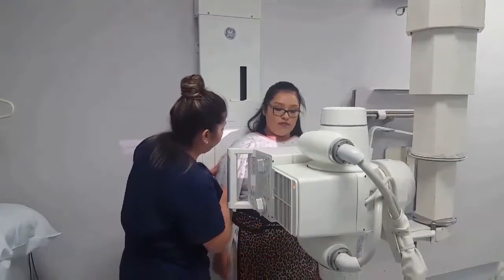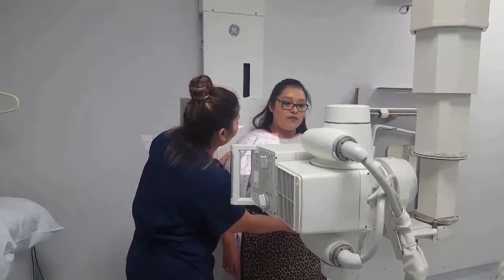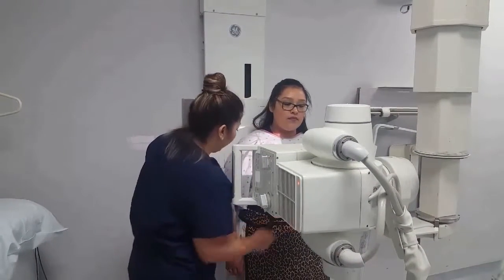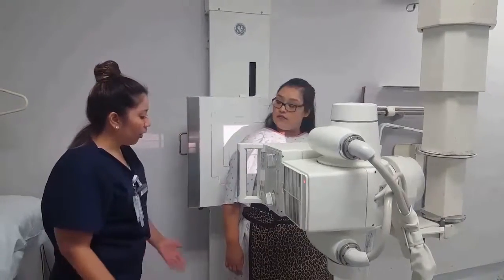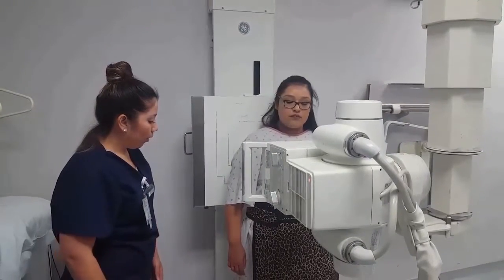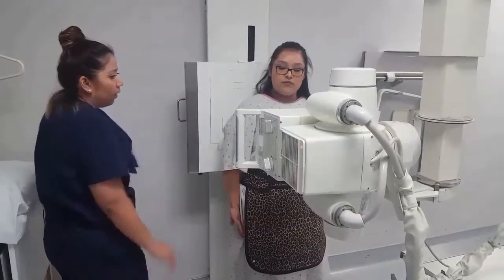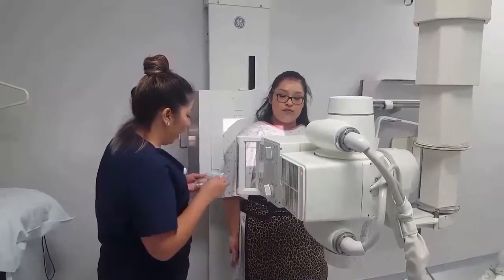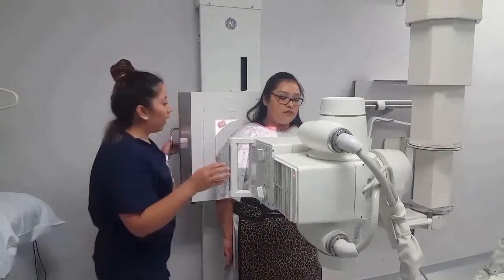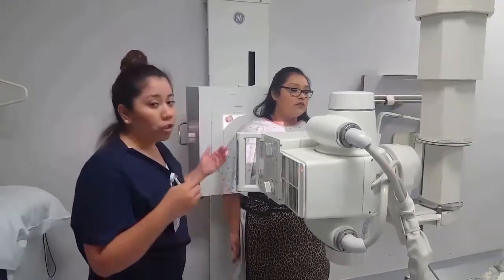So I'm going to go ahead and move my patient a little bit towards their left side. And that will be fine there. And then also, ma'am, since we're doing first the internal rotation, I'm going to ask if you could put the back of your hand towards your side. So once we have that there, then I'm going to put my marker. And then just making sure that my tube is aligned to my wall bucky, which in this situation it is.